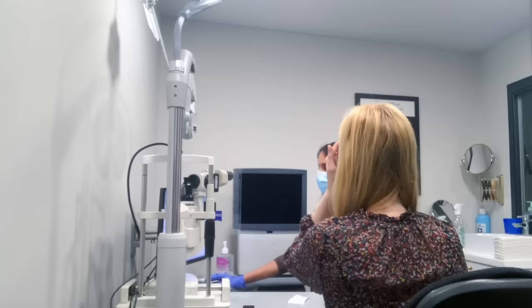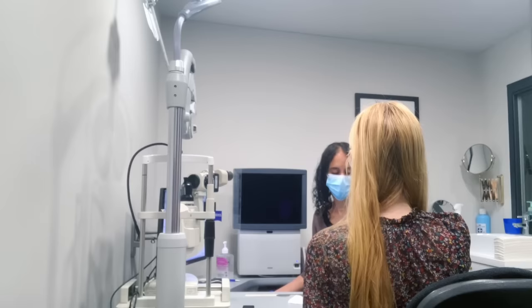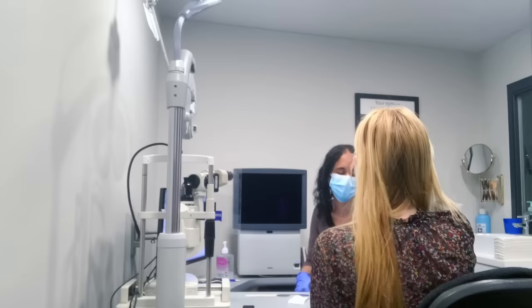And then how about with your other eye? So if you swap over, brilliant, have a few blinks. And these lines are all the same size. Could you make out any from the top? D, N, Z, L. Very good. And then any from the middle, if you can, there. Hope they're not steaming up too much. Yeah, with the mask. Feel free to lower your mask. The middle. V, F, L, N.